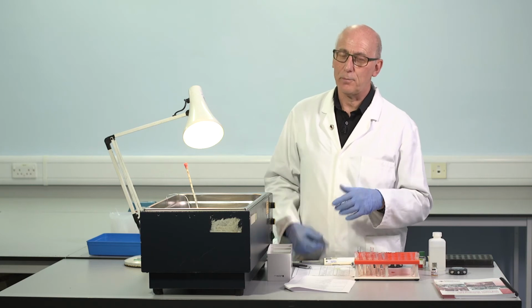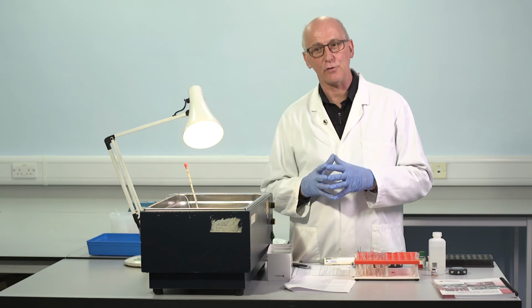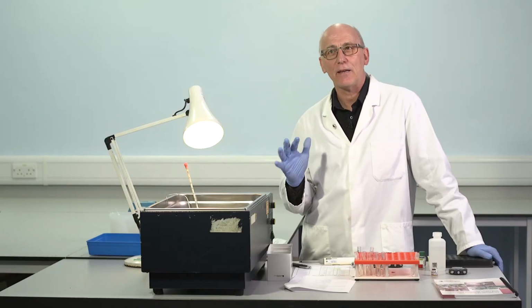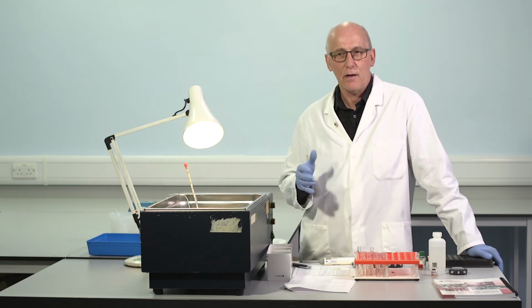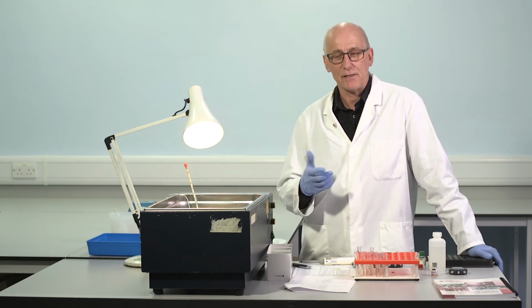We need the graph paper and the plot to really draw a safe conclusion on that, because of course we made some dilution of patient samples. But of course we often have some information in advance of beginning the factor VIII assay. We often have some information about the anticipated levels of factor VIII. We may have past results on the same patient. We may know this is a family with severe haemophilia. This is a patient with severe haemophilia without recent treatment. So we often have some indication in advance of what we might expect.